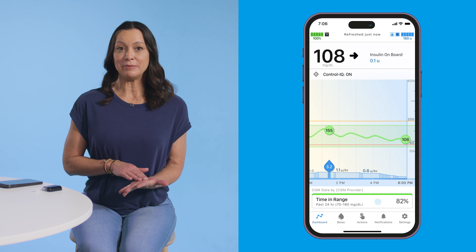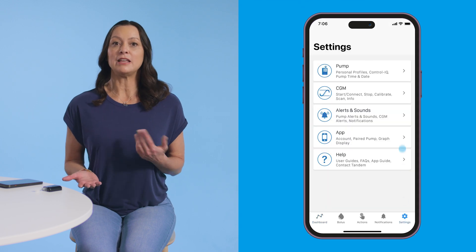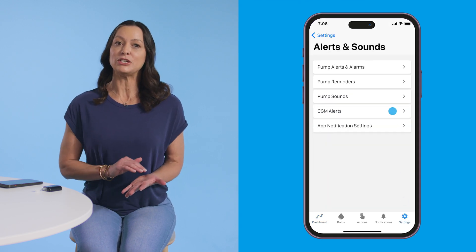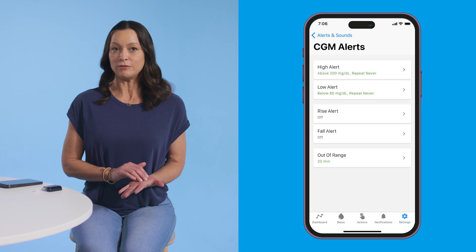To customize glucose alerts on your Tandem Mobi system, open the Tandem Mobi mobile app. Navigate to settings, then alerts and sounds, and then CGM alerts to turn on or off.